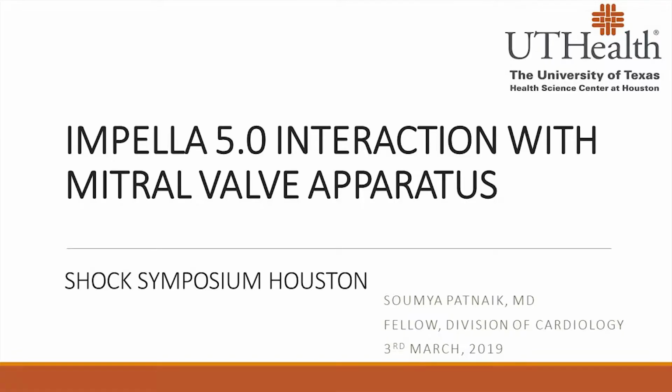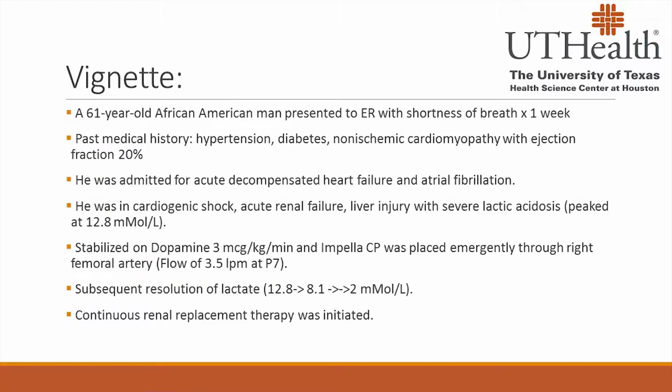I'm going to talk about a case of unfortunate interaction of Impella 5.0 device with mitral valve apparatus. Our case is that of a 61-year-old African-American gentleman with history of non-ischemic cardiomyopathy, ejection fraction of 20%, who presented to the emergency room at an outside hospital with acute decompensated heart failure and atrial fibrillation, which was uncontrolled. He was quickly recognized to be in cardiogenic shock, multi-organ failure.